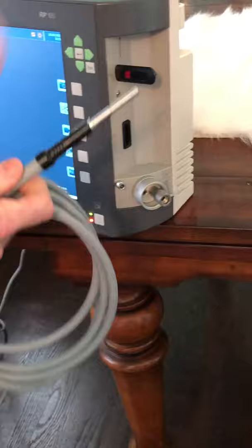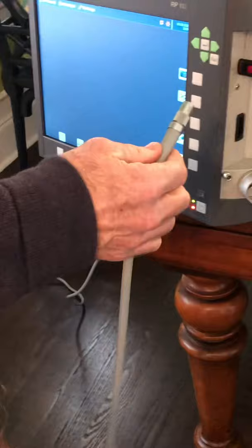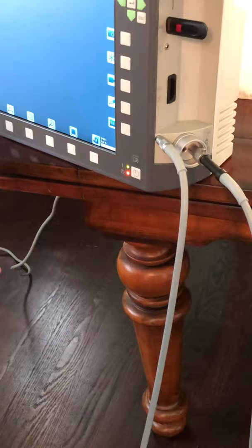This adapter goes into the larger of the two holes — push it all the way in until it clicks. Then the male end of the light cable plugs right into the adapter. While you're grabbing other items, this piece can just screw onto there to hold it in place.